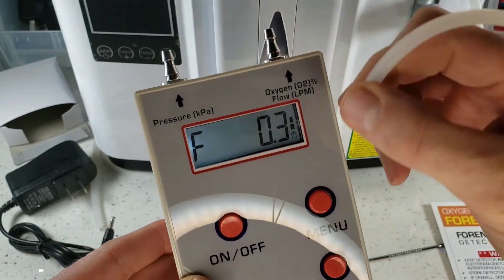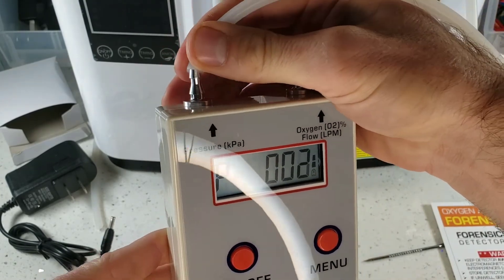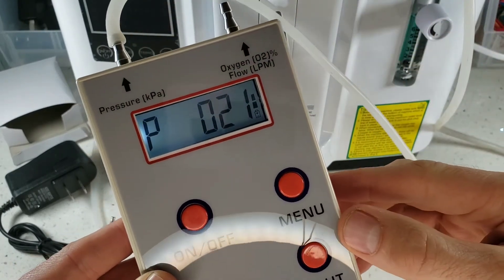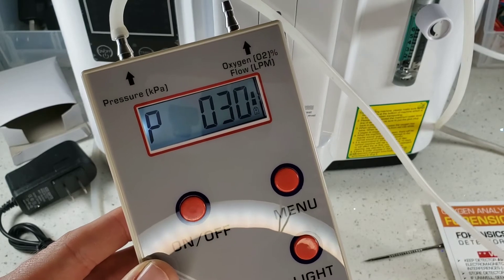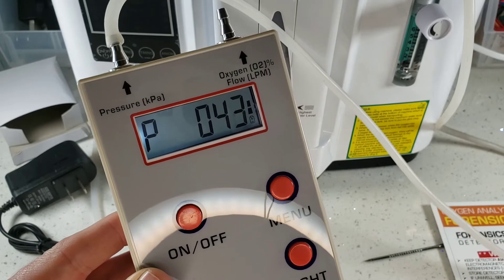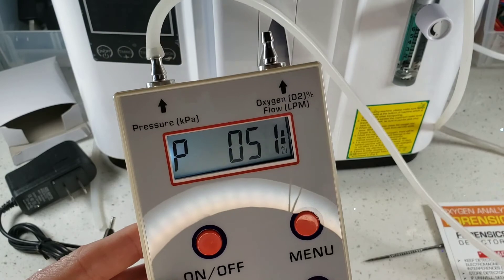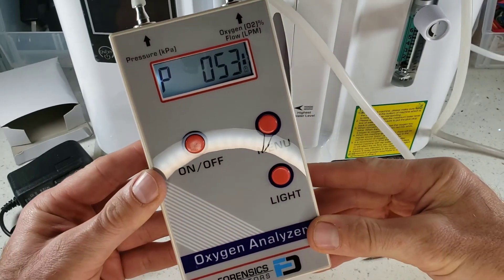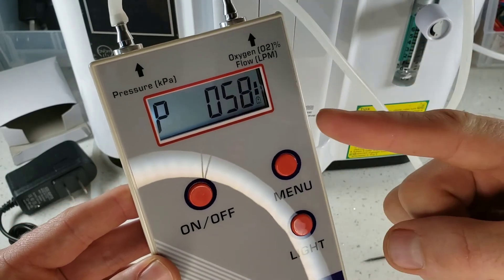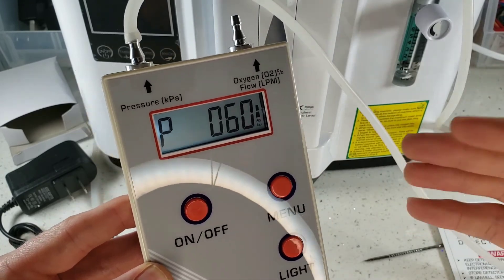Let's go to the pressure sensor — switch to P for pressure — and check how much pressure this machine can push through into the connectors. It's going to start rising. This is all in kilopascals. The digital pressure sensor is slowly creeping up to about 50 or 60 kilopascals for this machine. And that's basically it, folks — this is our gorgeous oxygen analyzer for your oxygen concentrator and machine. I hope you enjoyed the demonstration. Have a great day.